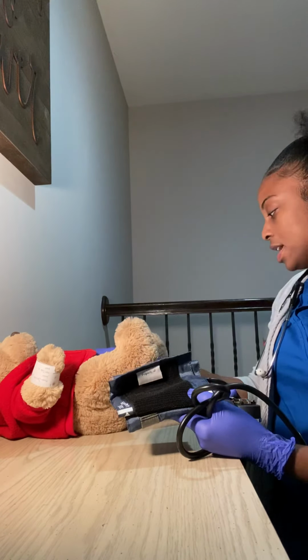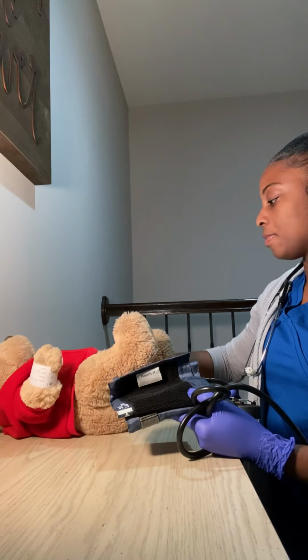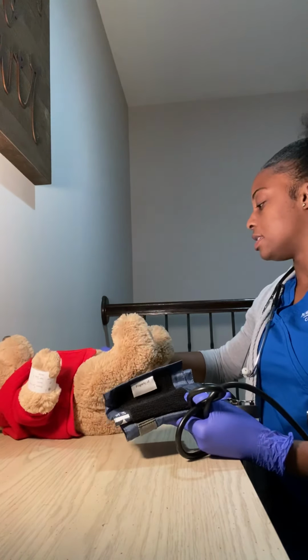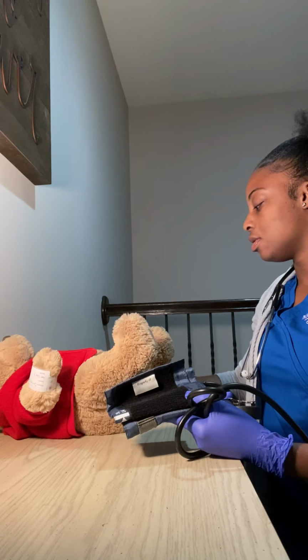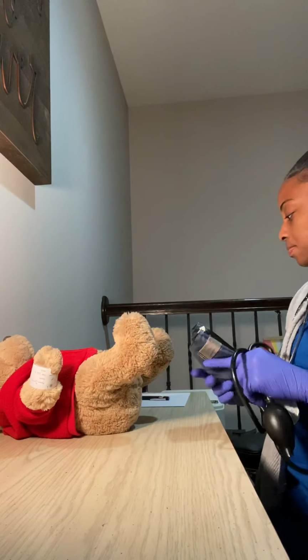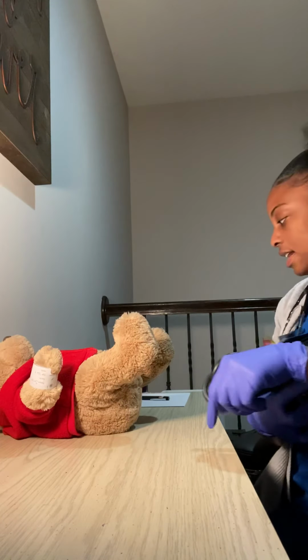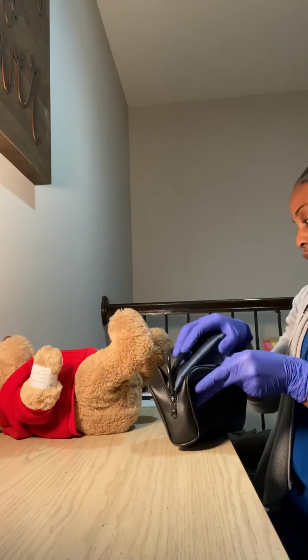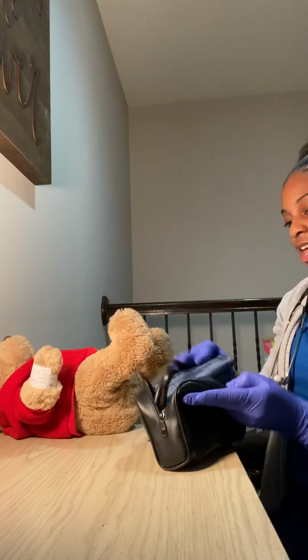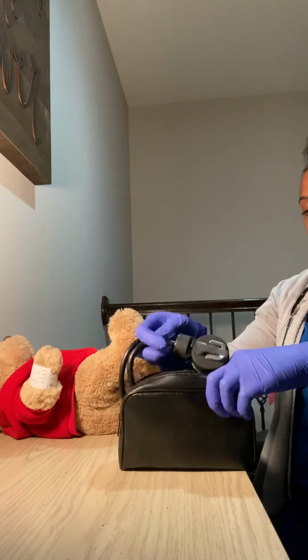Her respiratory rate is 32. Her pulse that I'm gonna take, a radial pulse. And we got 100. And then her temperature is 97.9 degrees Fahrenheit with her O2 sats of 89% on 30% FiO2. So we know that she's gonna need some suctioning.